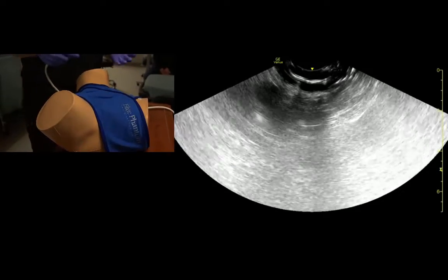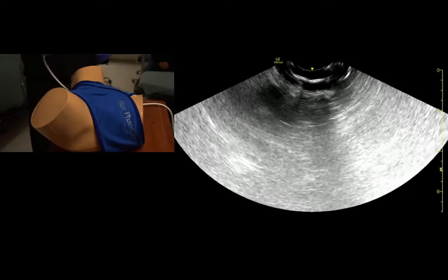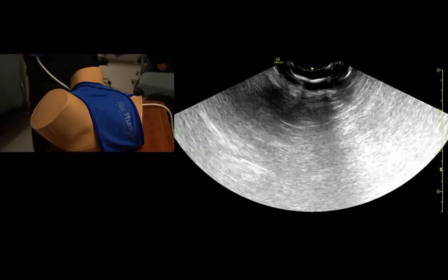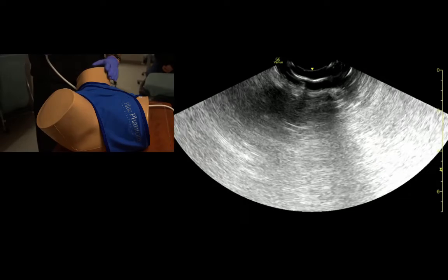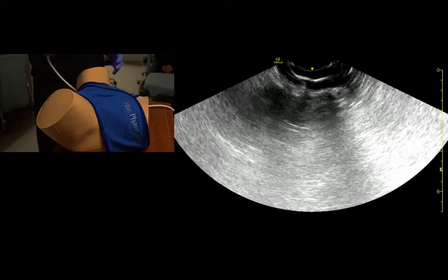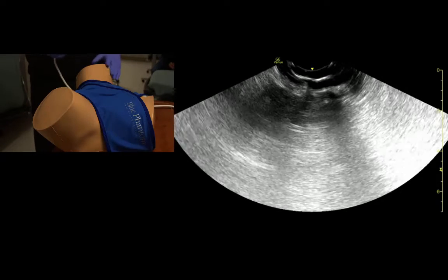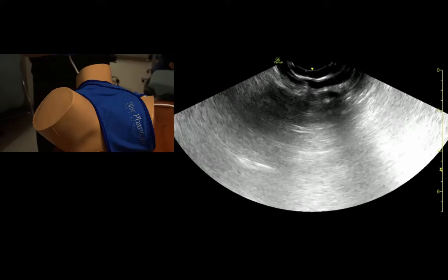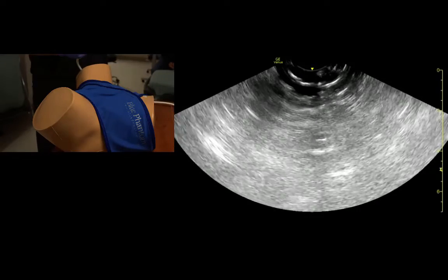For transvaginal ultrasound, the reason we do this is the probe is higher frequency and it's closer to the anatomy, where we can see ovaries and adnexal things in a lot more detail. Patients should be in the dorsal lithotomy position, just like the pelvic exam, and ideally they have an empty bladder. In real patients that aren't plastic, we use a cover and we have a sterilization or high-level disinfection procedure that we go through.